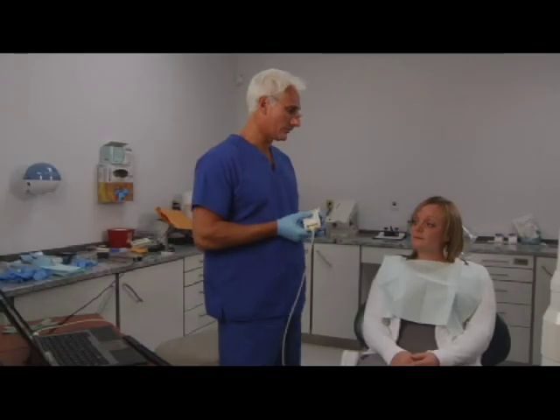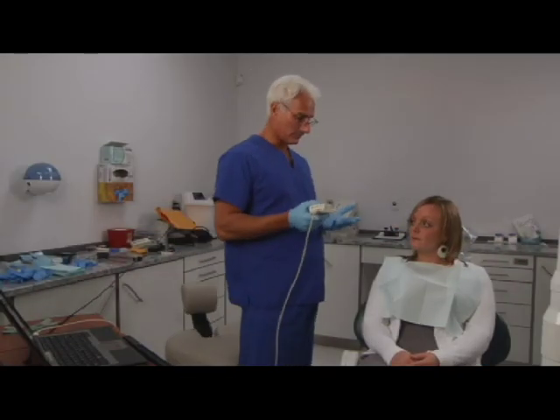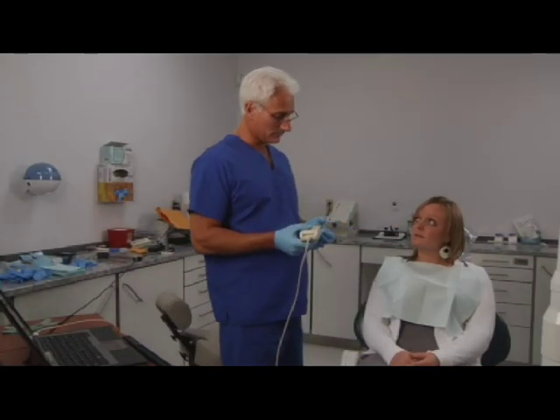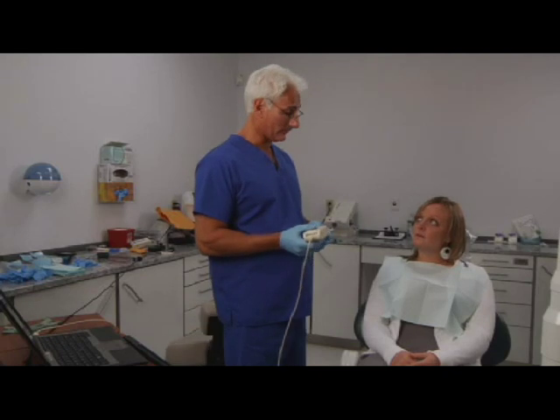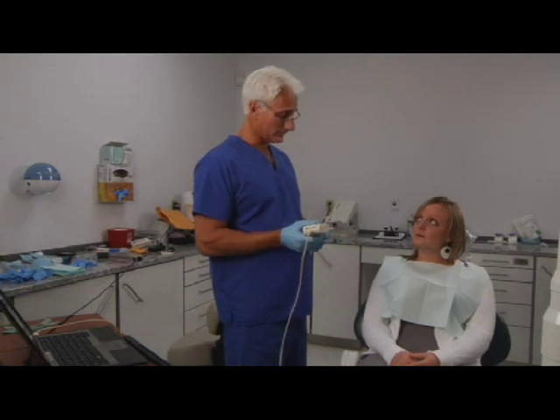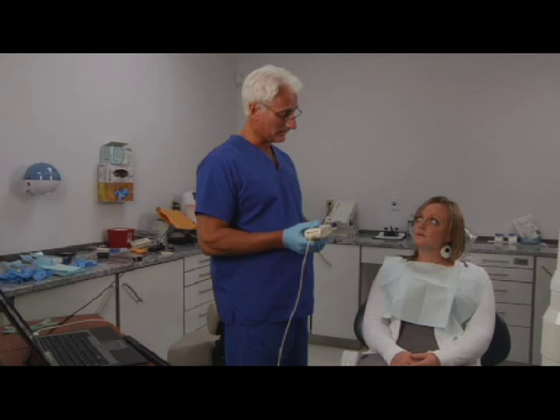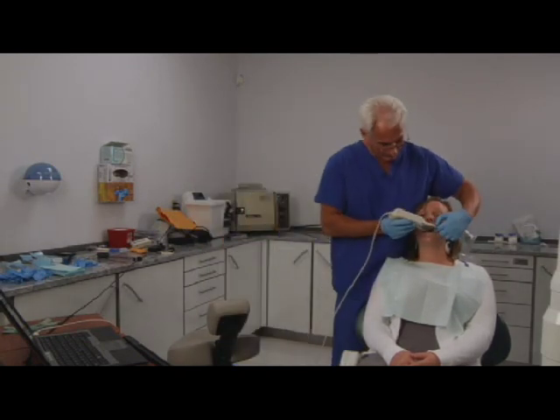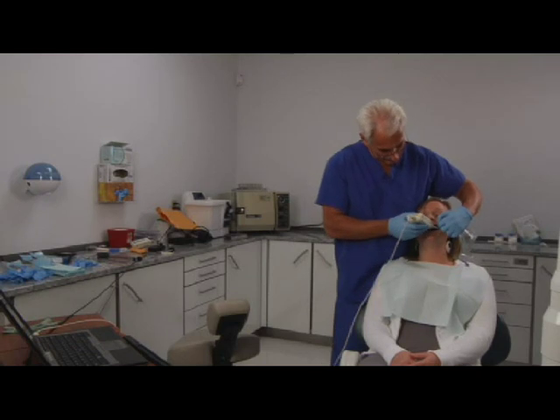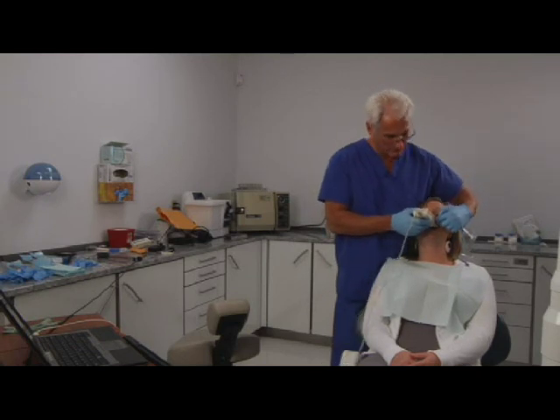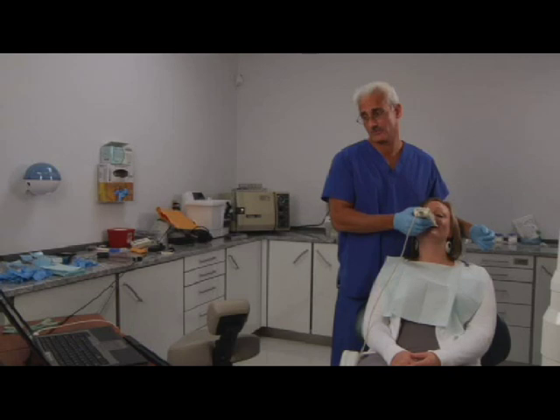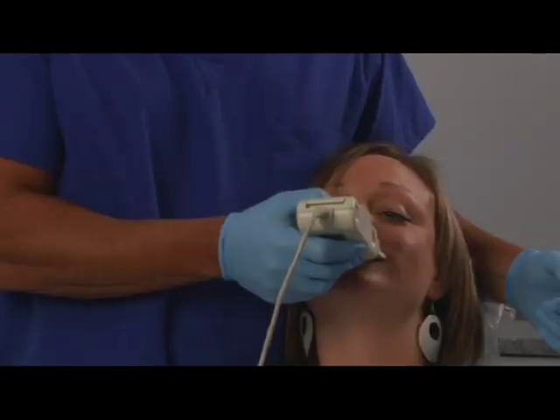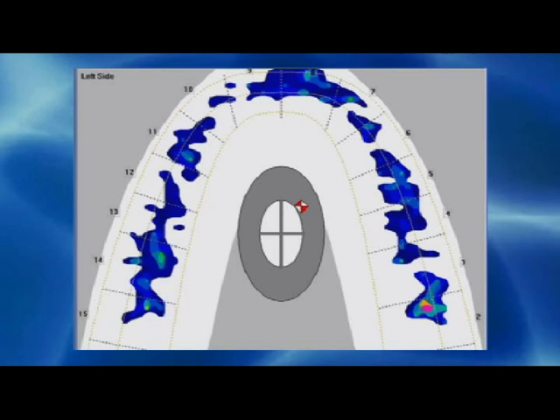Now we're going to record your three excursions: right, left, and protrusion. We're going to do the right one first. I'm going to have you bite down through the sensor, hold your teeth together, and then slide to the right. Each time, before I record, I'm going to have you close fully into the sensor to make sure you're seating your bite correctly. Go ahead and bite down firmly and open, bite down again — now slide to the right.